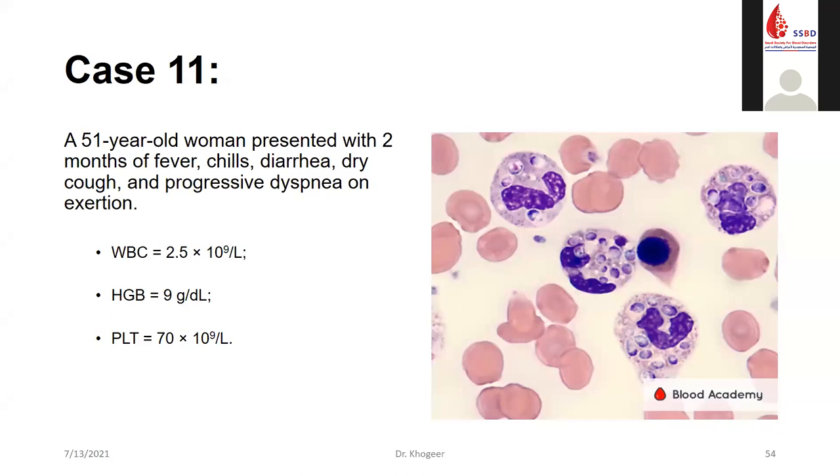Okay, so this figure is showing leukocytes phagocytizing a yeast form. This yeast form is Histoplasma capsulatum. Usually Histoplasma will be engulfed by neutrophils, monocytes or histiocytes. It's not like Leishmania, which is more often extracellular.